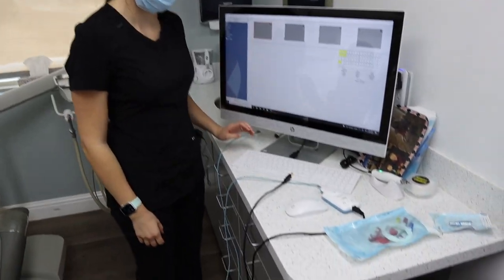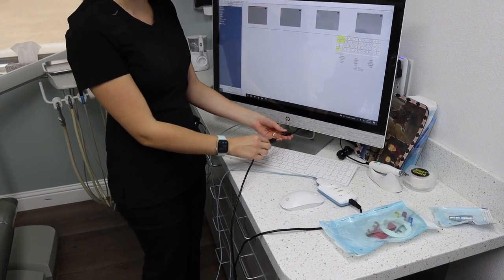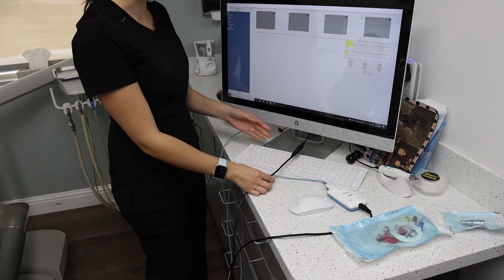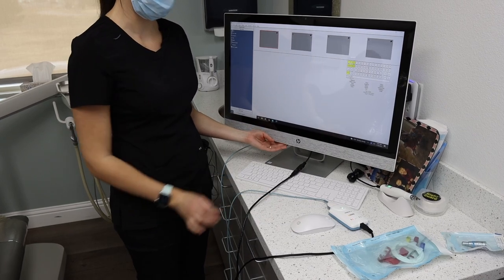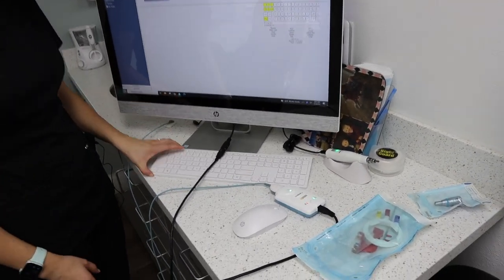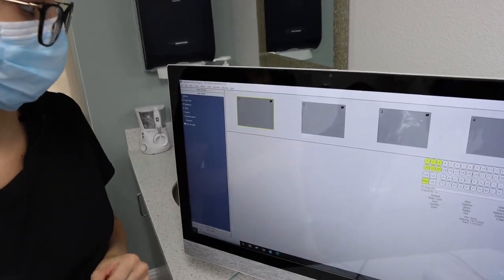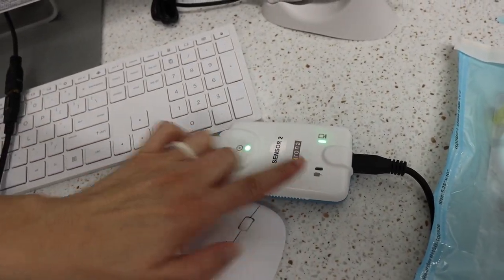We're now going to take some bite wings. You want to plug the sensor into this USB, and you want to make sure to use this USB rather than the one at the back of the computer, so you don't wear out the USB connection on the back of the computer. When you plug in the sensor, you want to make sure the screen is flashing blue and yellow, and you also want to make sure that there are two green solid lights and a blinking red light.